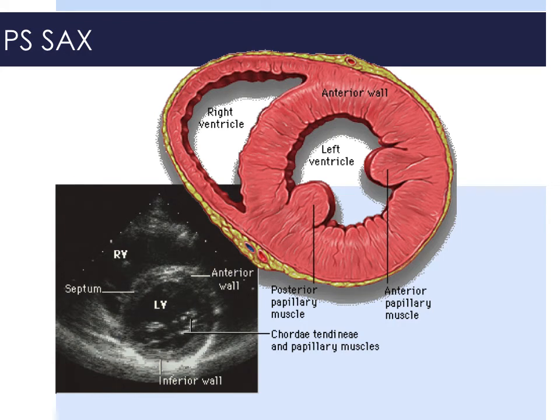Once we have completed our assessment on the parasternal long axis view, we move to a parasternal short axis view, simply rotating the probe from the right shoulder, moving the notch towards the left shoulder. We stay in the same intercostal space.